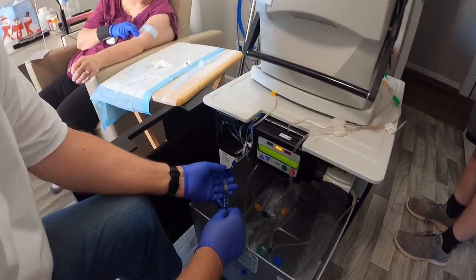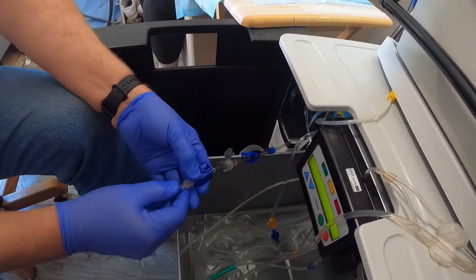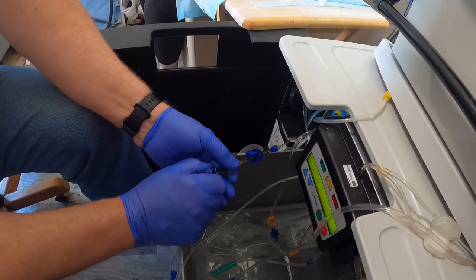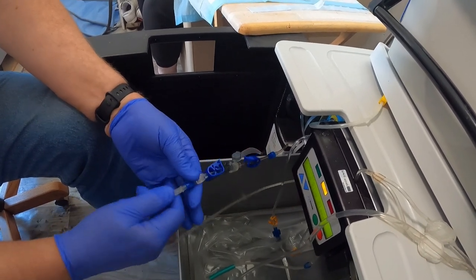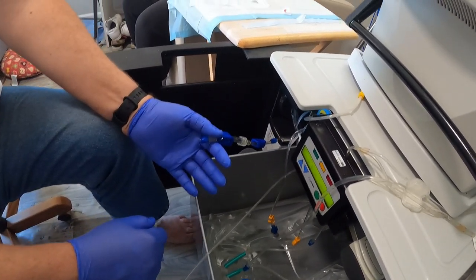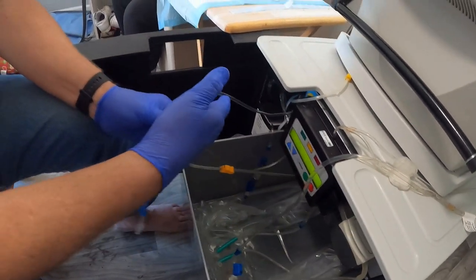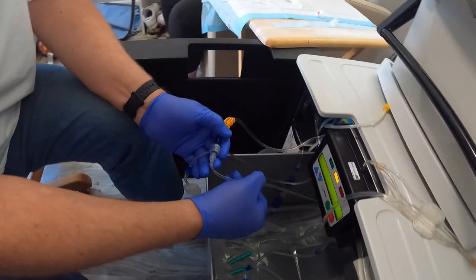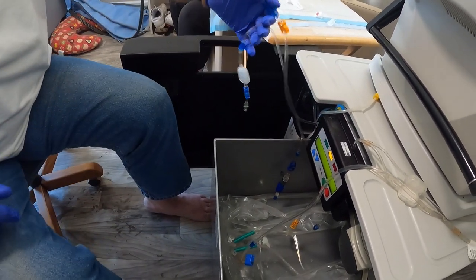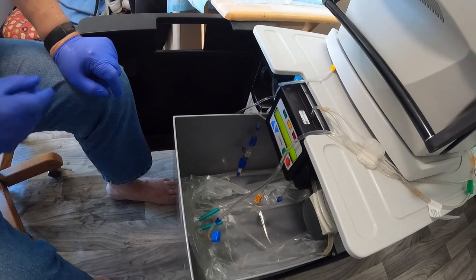So we close the blue clamps. This one is the most important one because that's what turns the water off. If I unscrewed this with that open, you'd have water, lots of it. So you close them all. Then I unscrew this one, leave this part. This is how I know where I am, because I left that part. And then I close these two and unscrew this. That leaves us with the machine. That's what these lines are. And then I say, yes, I did close those blue clamps.